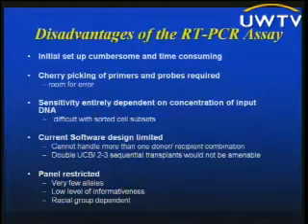The current software design is very limited. We've designed it so that it can only handle one donor-recipient combination. So if you had 2 umbilical cord blood units or sequential transplants, the program couldn't handle them. The panel is restricted, as I've just shown you. It's not as informative. Its discrimination is nowhere near as powerful. It's very heavily racial group dependent as well.